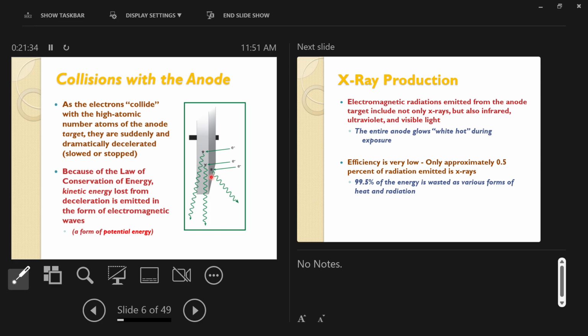Now that you have fast-moving electrons moving half the speed of light across a gap, what's going to happen to them? They need to decelerate, right? When they're moving fast, what kind of energy do they have? Kinetic energy. When they decelerate, we could say like an individual electron is losing kinetic energy as it decelerates, right? But we know that energy is not lost, it's converted. So kinetic energy is converted into what type of energy when they decelerate? Electromagnetic energy.